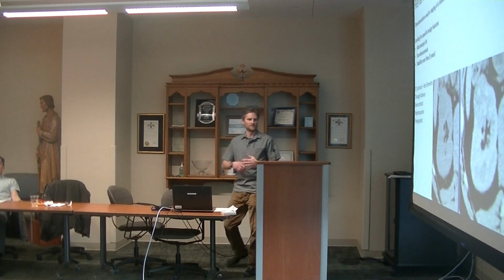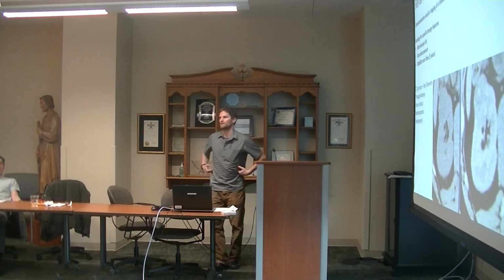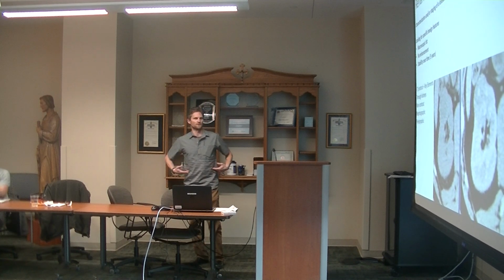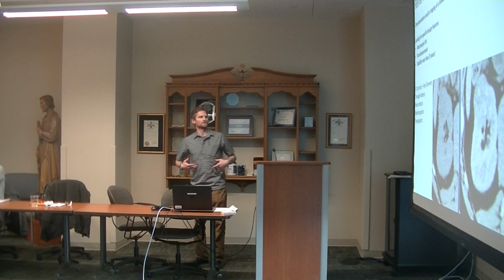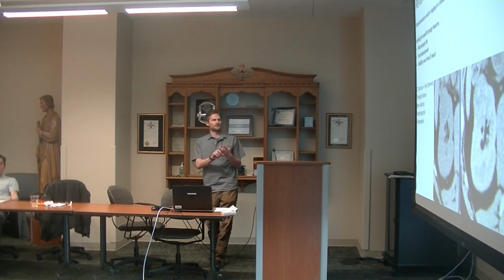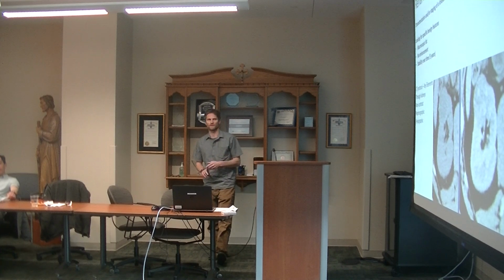The key protocol elements: we're really just going through the kidneys. We're not evaluating the lower tracts on these exams. So we just need through the kidneys or through the abdomen. Non-contrast, nephrographic, and pyelographic. So these are 3-phase exams.